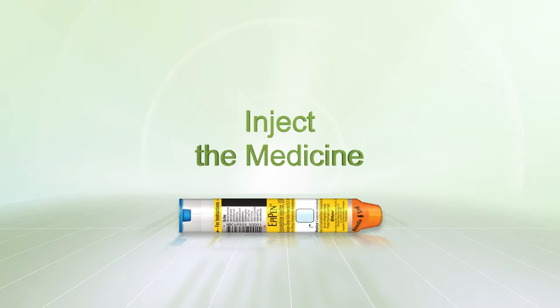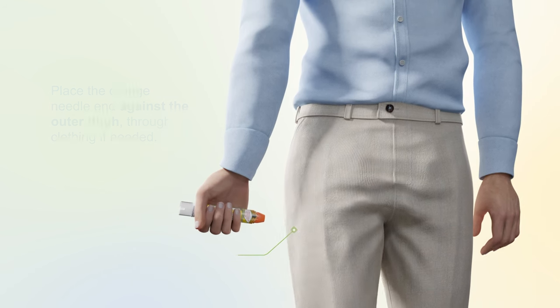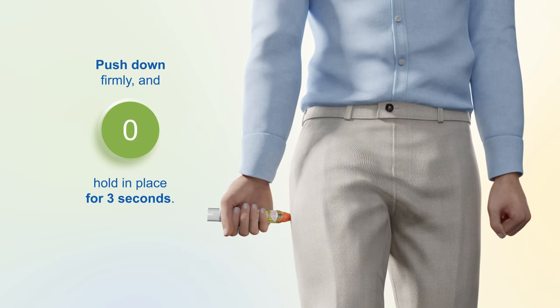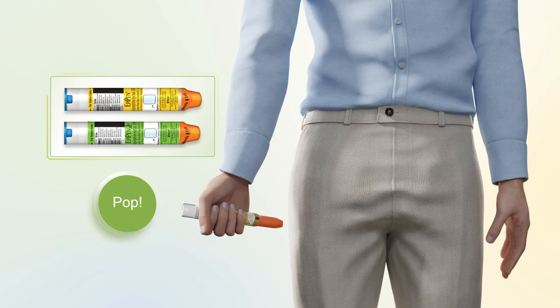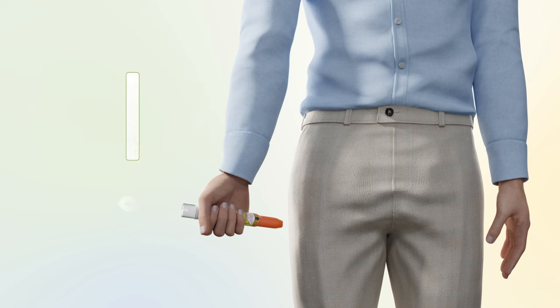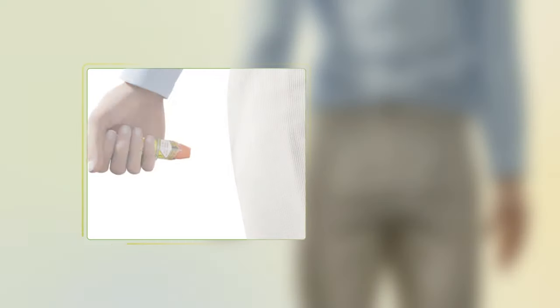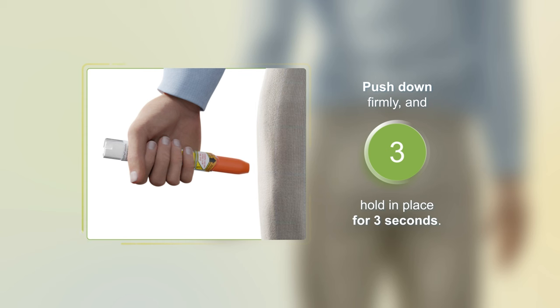Inject the medicine. Place the orange needle end against the outer thigh, through clothing if needed. Push down firmly and hold in place for three seconds. EpiPen and EpiPen Jr. auto-injectors make a distinct pop sound when pushed against the thigh — this is normal and means the auto-injector is working. After the pop, continue to press the auto-injector firmly on the outer thigh for three seconds to make sure the medicine is given.